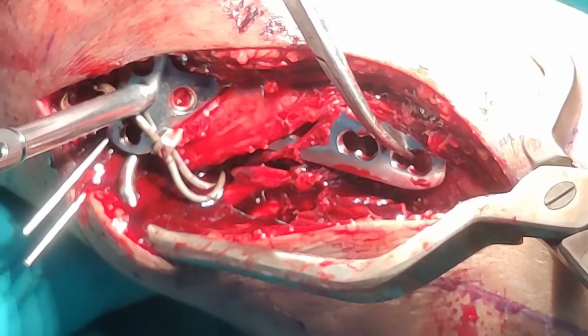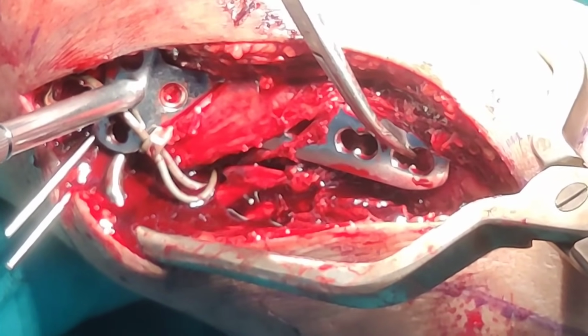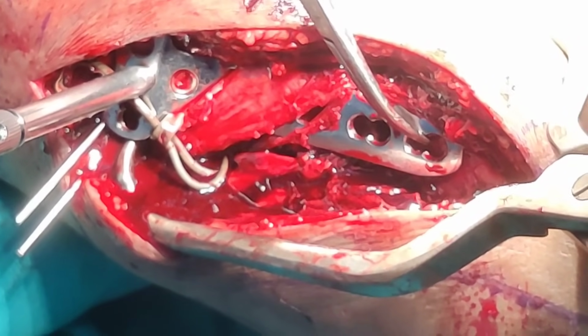You will see I'll deliberately put the wire especially more posterior, because if you are putting it in the center, then plate will come in the way. So once you are using provisional K-wire fixation, either put posterior or anterior so that you have got free space to put the plate.